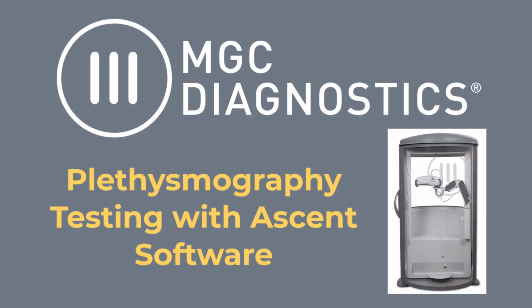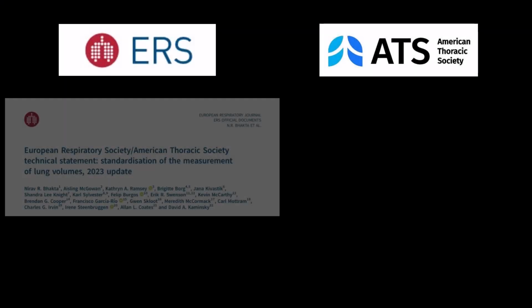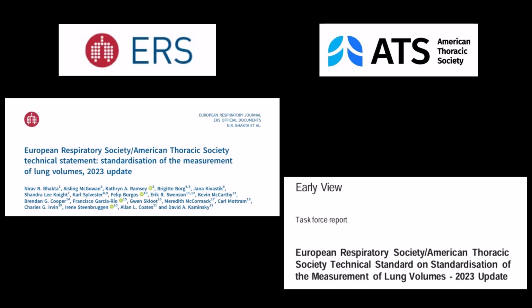In this video, we will discuss how to perform lung volumes and airways resistance testing with Ascent Cardiorespiratory software. In 2023, a joint committee of the ERS and ATS released new technical standards for the measurement of lung volumes. They also released a supplemental document that included the measurement of airways resistance.